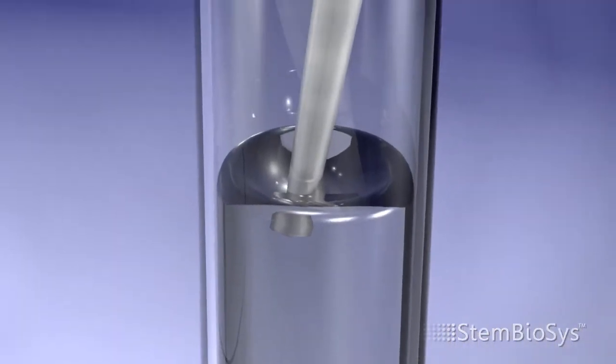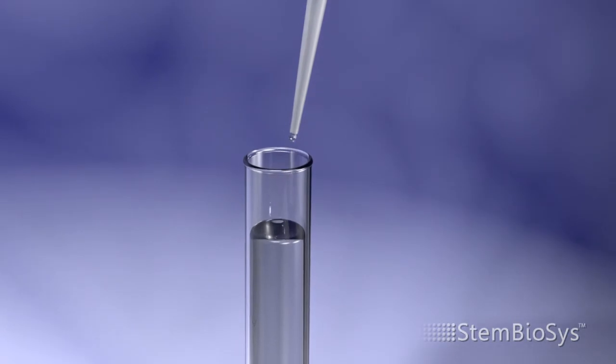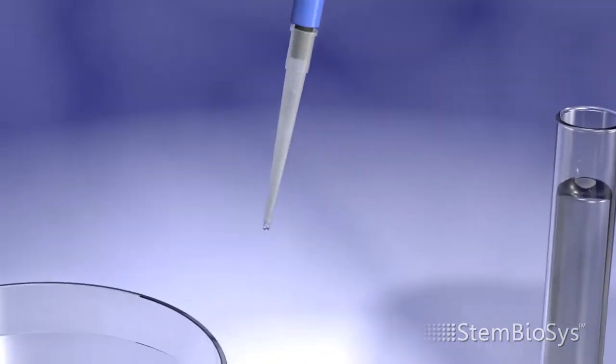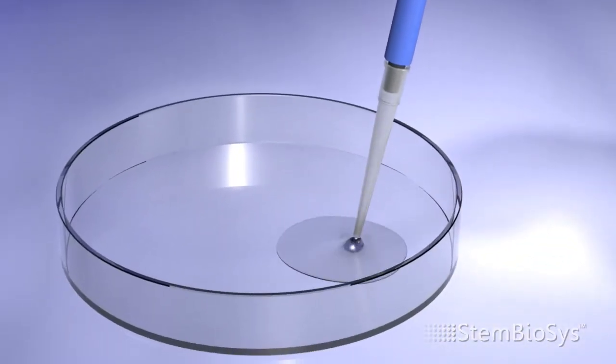We begin with a bank of commercially available bone marrow stromal cells from healthy young adults. These cells are then added to a standard cell culture dish.